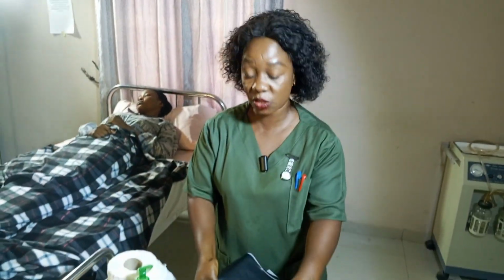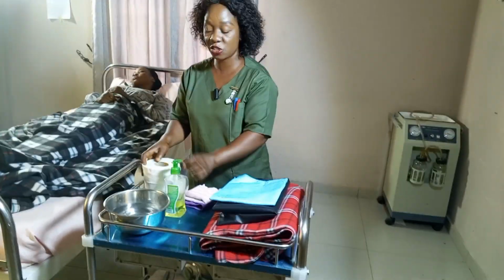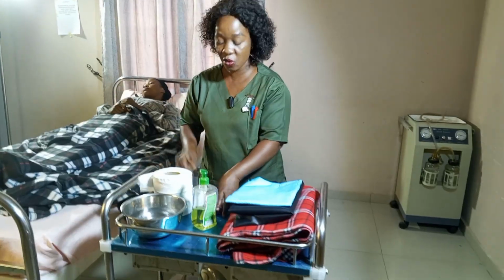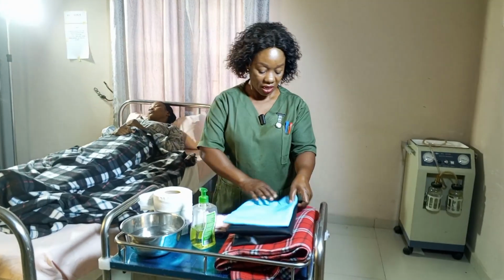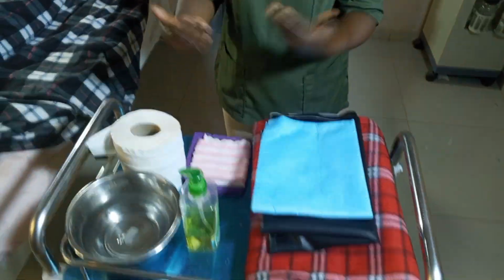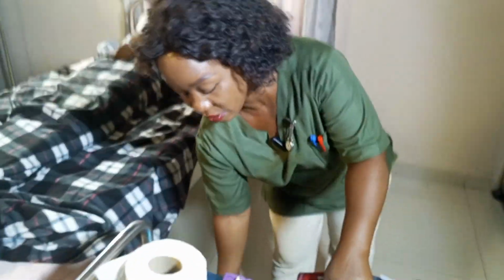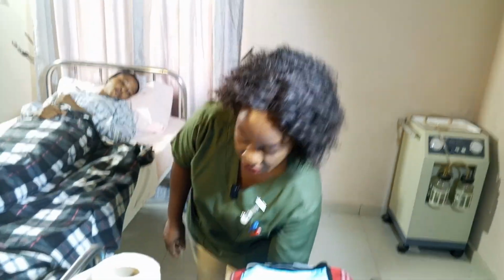So today, we are going to look at serving of a bedpan, and I have my supplies. That's my requirements for this procedure. I have my tissue paper, I have my hand wash, and I have my towels, and I have my bath blankets, and of course at the bottom shelf I have my bedpan, and also I have my glove.